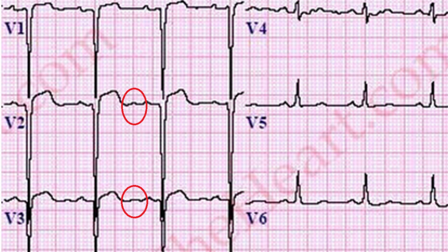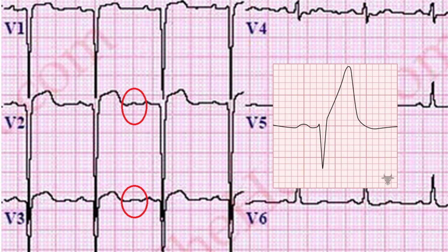The T waves are also important to consider in these patients because measuring the T wave can give you an indication as to whether or not this is a new ischemic event or a stable LV aneurysm. The T waves should be less than one third the depth of the Q wave, and there definitely shouldn't be any hyperacute T waves.